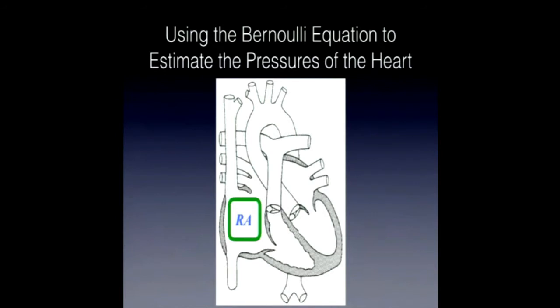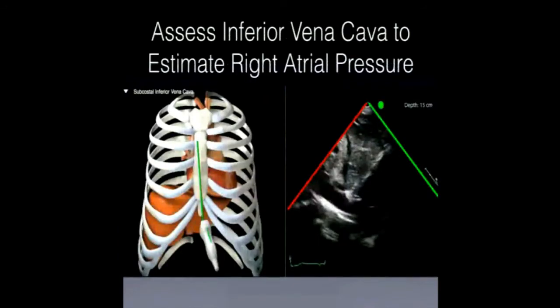But if we try to be a little bit more scientific about it, we'll look at the IVC, and now we'll consider our bedside focused ultrasound, and we'll put it on a sort of subcostal view, and we'll get the inferior vena cava, which is very doable. So pull out your machines and look at your patient's inferior vena cava. And this is the inferior vena cava, and to the right of that turquoise circle or squarish thing is the heart. So that's your inferior vena cava.